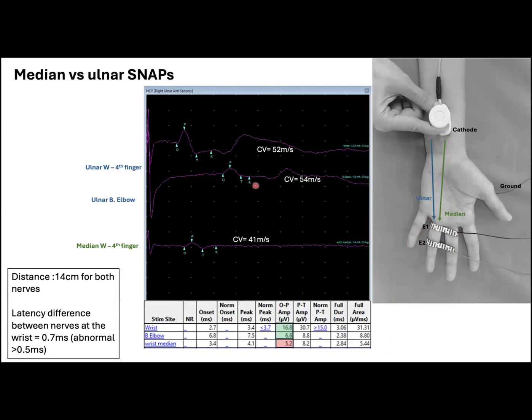Motor artifacts are common when recording from the fifth finger, but can also happen with the ring finger. Usually, this is not a matter of stillness or relaxation, but it is in fact the effect of a volume-conducted motor response.